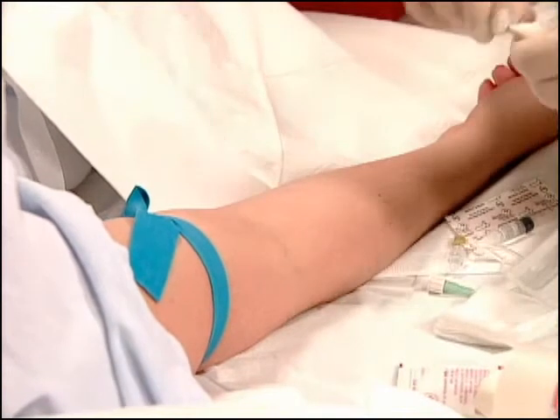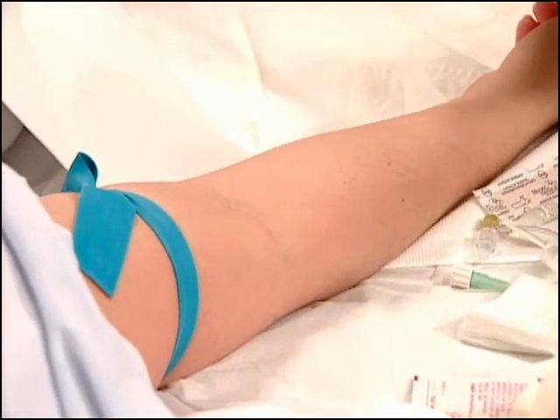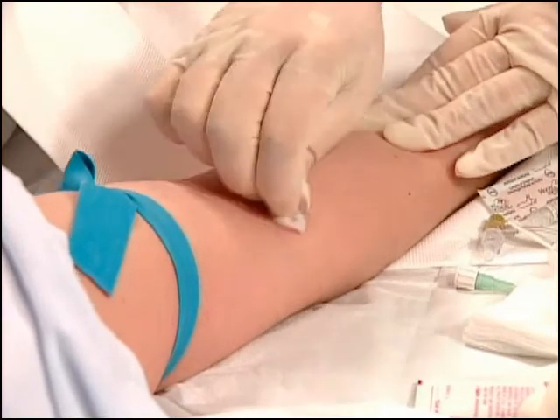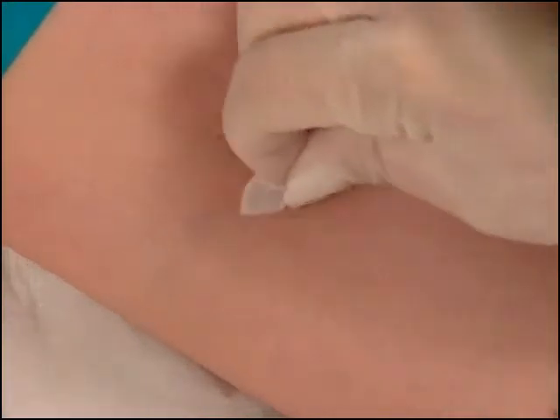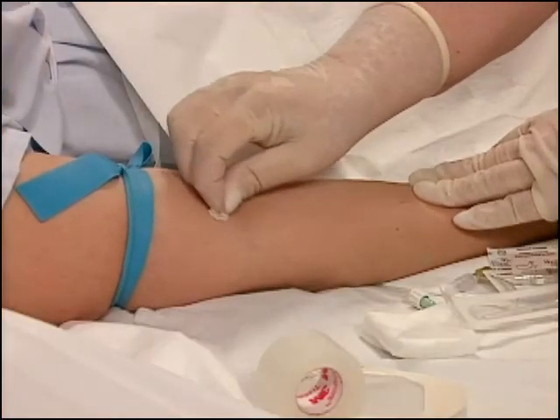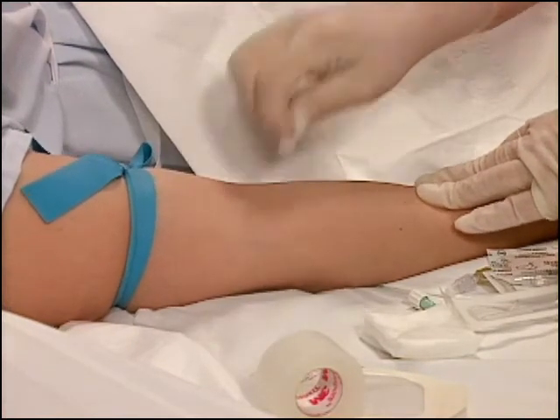Holding the alcohol pad or iodine swab in your gloved hand, wipe in a circular fashion from directly over the proposed insertion site in ever-increasing outward circles. Allow the wet area to air dry, or wipe with sterile gauze. Do not blow on or fan the site.